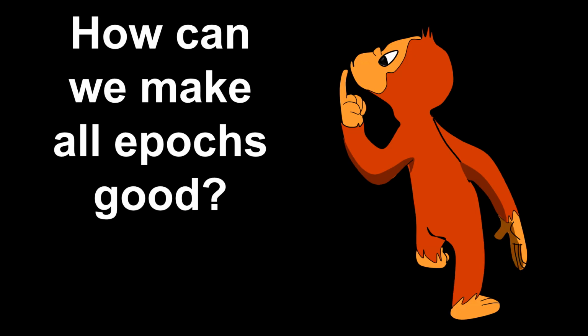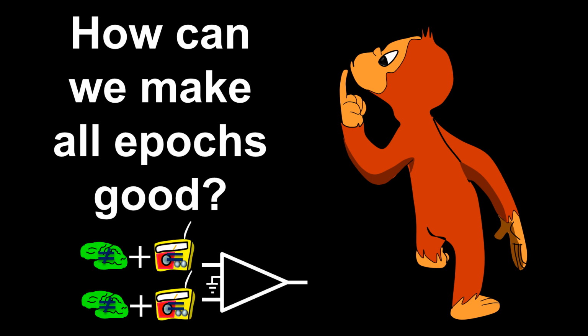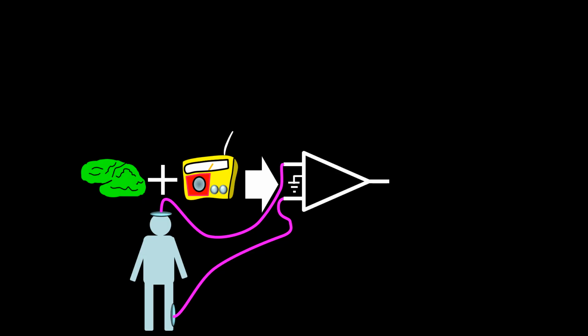Next, they considered connecting input 2 of the differential amplifier to a different body part. Again, this was done with the hope of capturing unequal brain electrical activity and equal noise. Probably one of the first body parts tried was one of the legs.